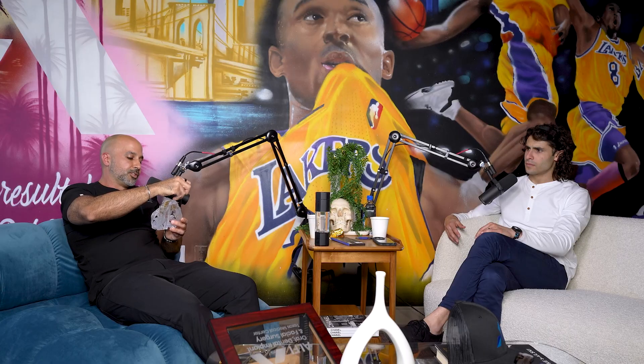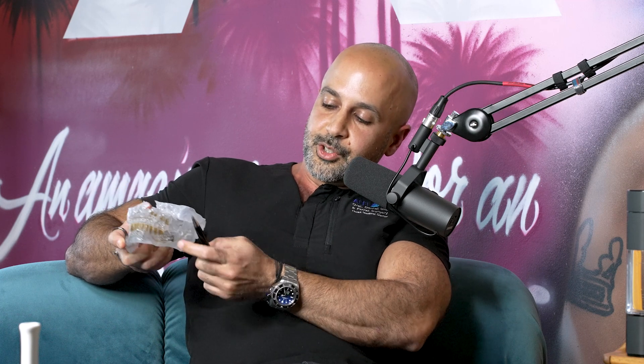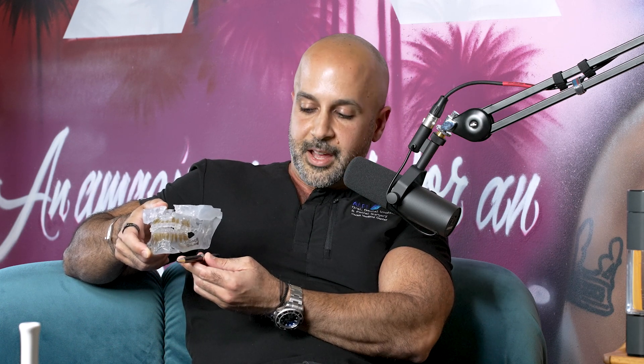I didn't really understand it until I transitioned to custom and got information from the custom plates that told me what was happening pre-custom. When you make a sagittal split osteotomy — that's the cut in the lower jaw — the cut goes from inside the lower jaw obliquely downward. You have two segments that are split and can telescope in any direction. The surgeon bends and conforms a plate, plating from one segment to the other once the mouth is wired shut. The back part — the proximal segment — is the segment that holds the condyle or the TMJ.